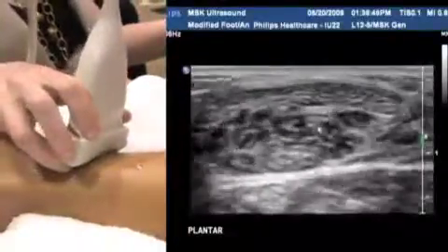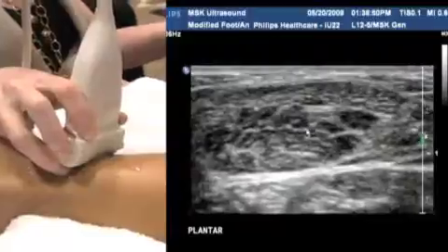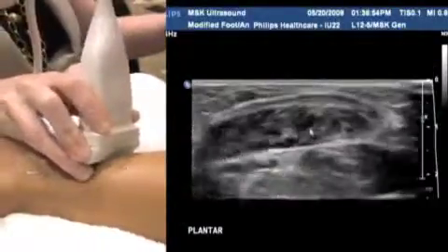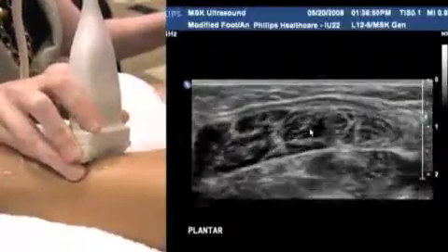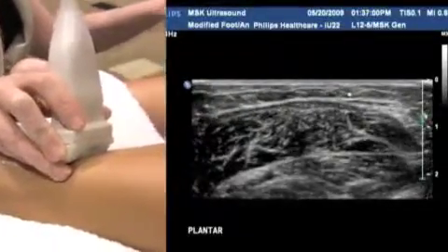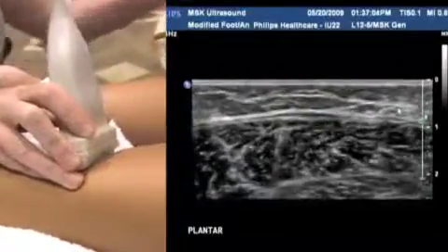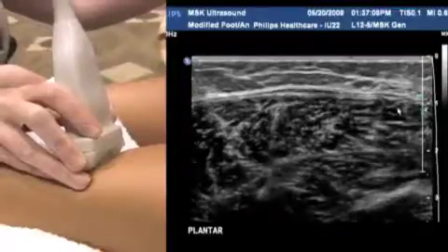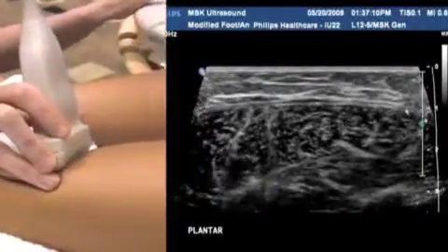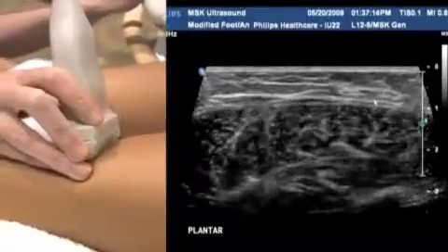As we move proximally, you'll see the Achilles tendon start to spread over its muscle. Quite normal. Let me just take it off the zoom so we can appreciate that a little more effectively. You can see the tendon gets really wide over the top of the gastrocnemius muscles there at the back. You can see it gets really thin proximally, stretching all the way out.